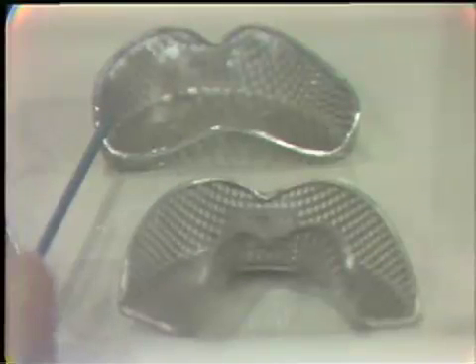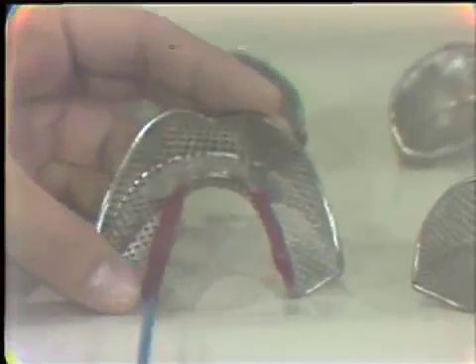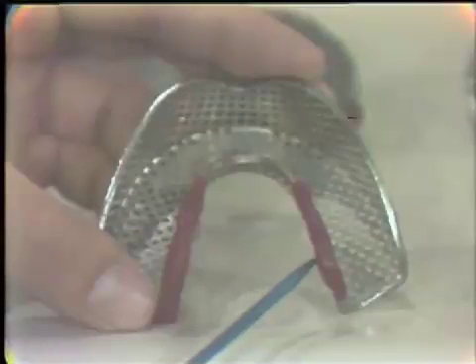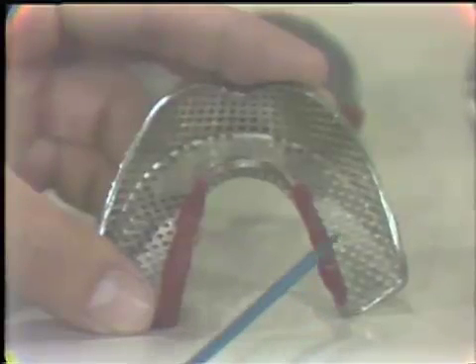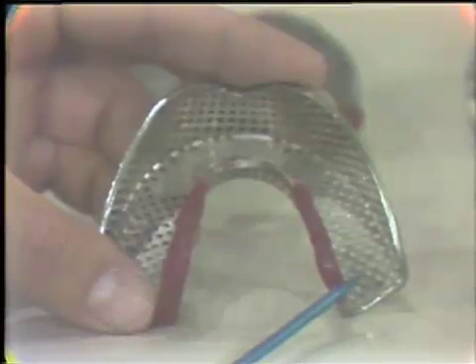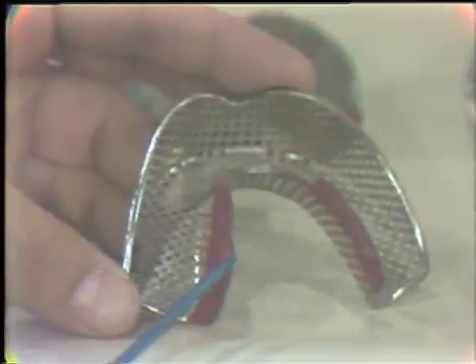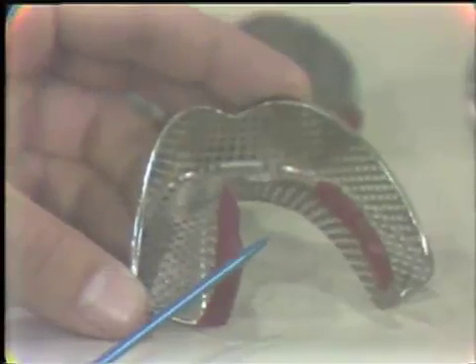For the partial denture, we use stock metal trays, perforated, and we modify them with red utility wax. The mandibular tray is altered in the mylohyoid area to depress the soft tissue attachments slightly, to give an accurate appraisal of the ridge — realizing we are displacing soft tissue and will not use the cast for determining that border. That will be done as a secondary procedure later on in partial denture construction.